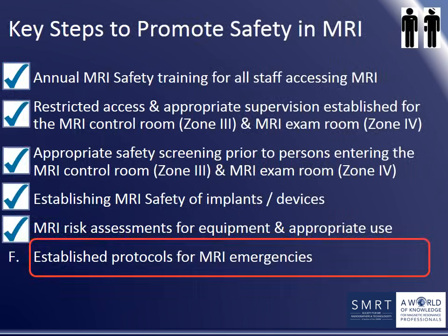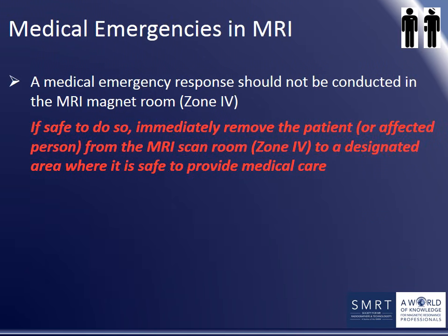The final key step to promote MRI safety that we will discuss is to ensure that you have established protocols for MRI emergencies. Medical emergencies can occur in MRI. Ideally, a medical emergency response should never be conducted in the MRI scanner room.